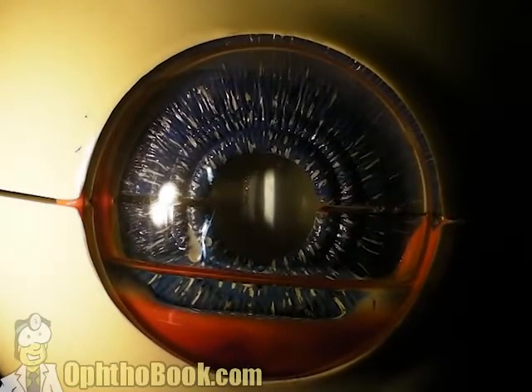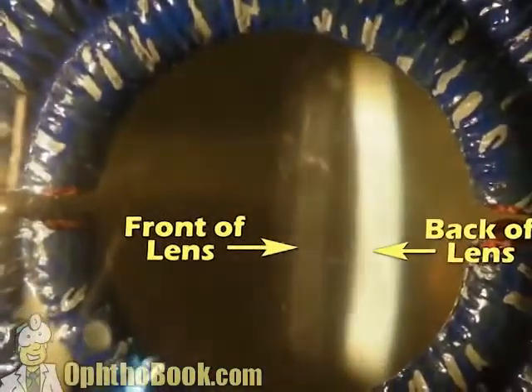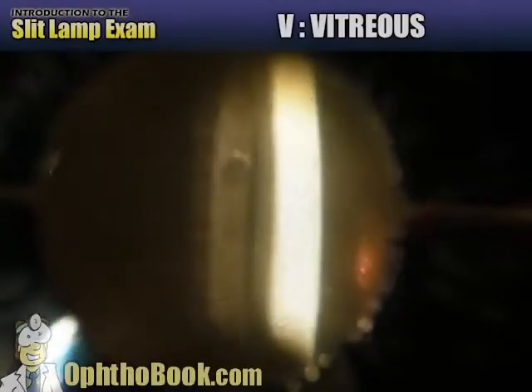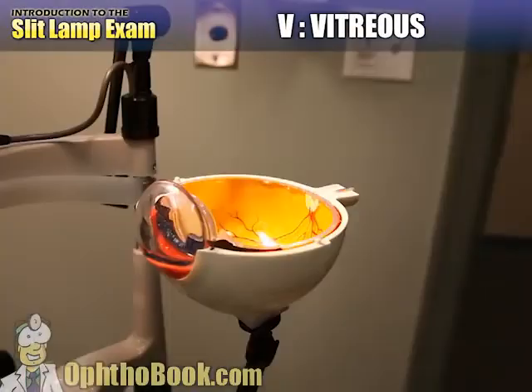So if we zoom in here, you can actually see the front of the lens here, and the back of the lens is here, and the part in between is the lens nucleus. That's where people mostly develop their cataract. Behind the lens, of course, is the vitreous cavity, and it mostly looks dark because for the most part it's optically empty. But it's not truly empty.